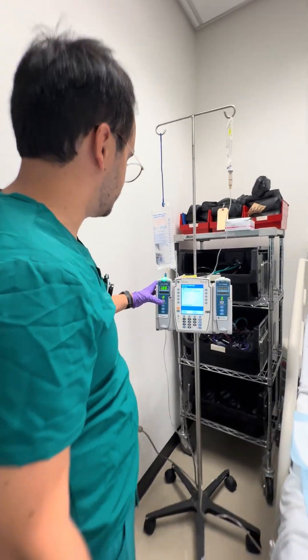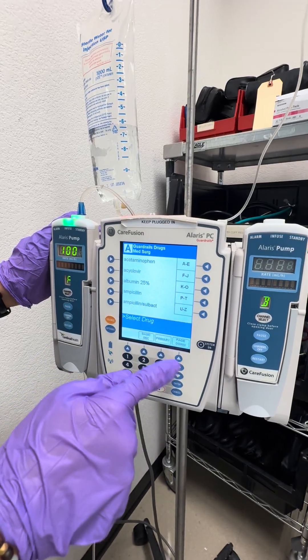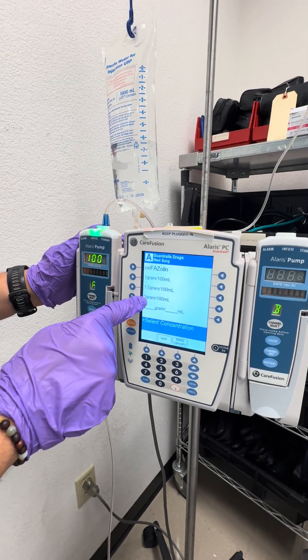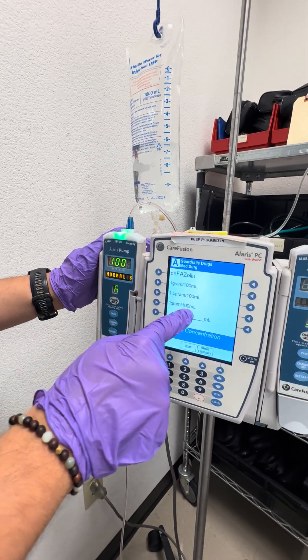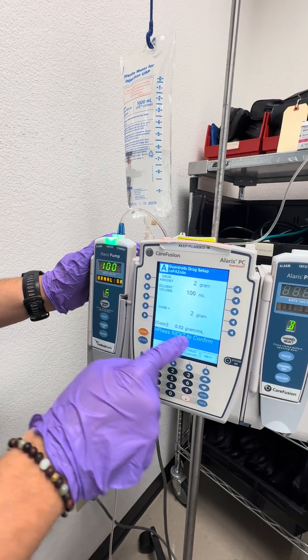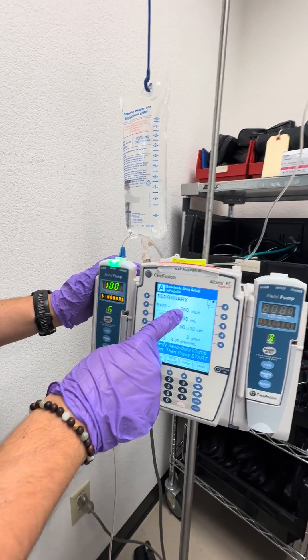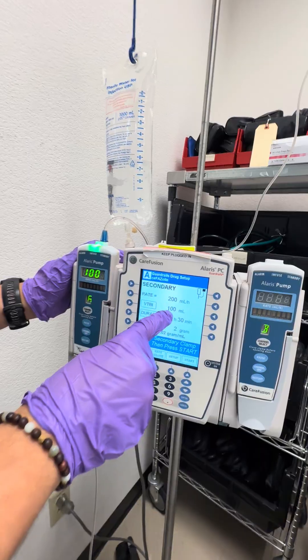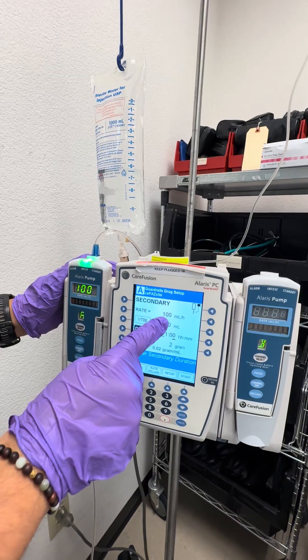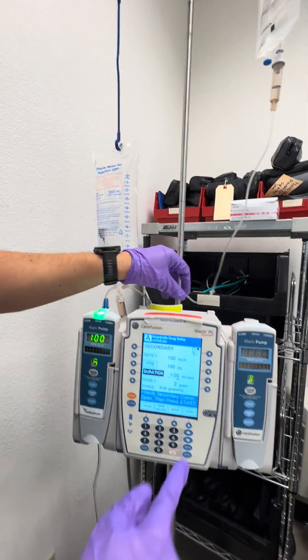We press channel select and select secondary on the pump. We find cefazolin — C for cefazolin — and select the pre-programmed concentration of 2 grams (2,000 milligrams) in 100 milliliters. We confirm the order is correct. The default rate shown is 200 milliliters an hour, which is not what we want; we change the duration to one hour so the rate becomes 100 milliliters per hour, which is what we expect. We confirm the settings and press start.